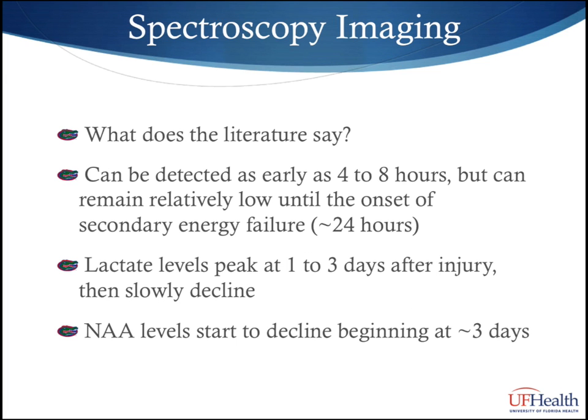According to the literature, a lactate peak can be detected as early as 4 to 8 hours, but remains relatively low until the onset of secondary energy failure, which occurs around 24 hours. The lactate levels will peak at 1 to 3 days after injury, then slowly start to decline. The NAA levels typically remain in the normal range until about 3 days. This may not be true in profound injury, but generally holds true in more subtle cases.